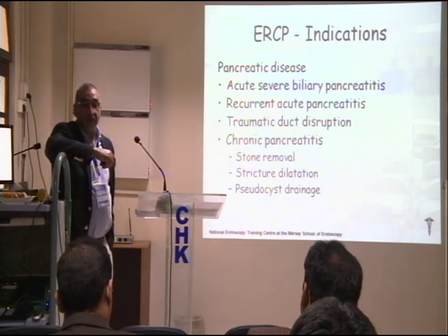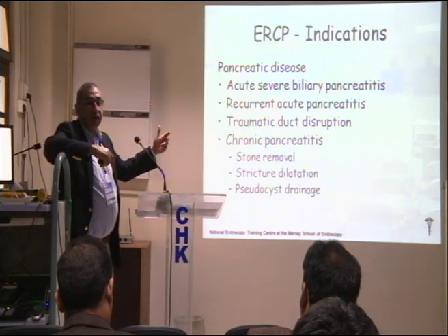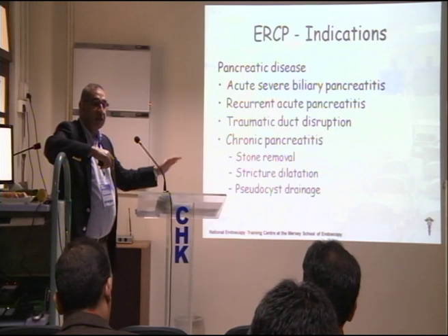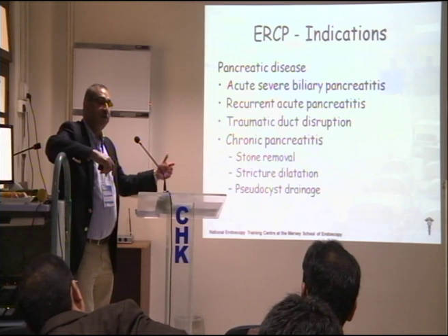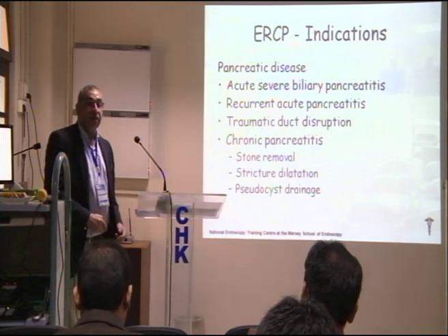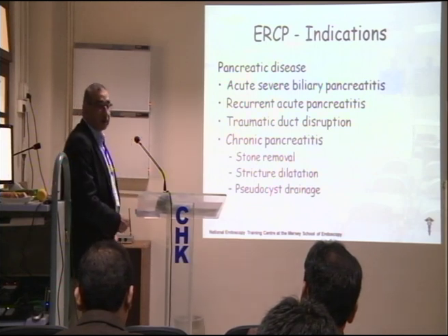It's always very challenging to do ERCP in acute severe biliary pancreatitis. It can be life-saving, very important, if the patient is getting worse. The indication is also important, because in biliary pancreatitis, if the patient is getting better and everything is settling down, you don't need to do an ERCP. Let it settle down. You can do an elective ERCP a few weeks later. However, there are conditions when these patients need an emergency ERCP because the patient is getting worse, the jaundice is getting worse, and they are slipping through.